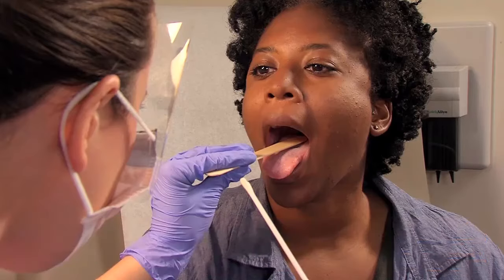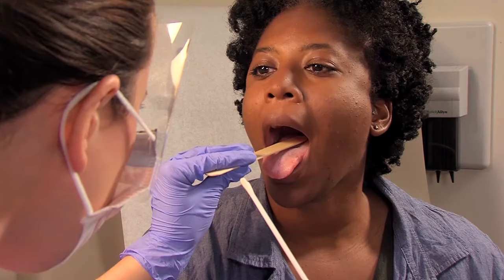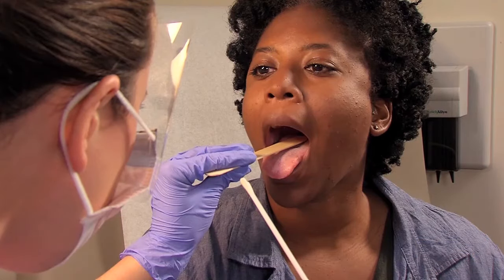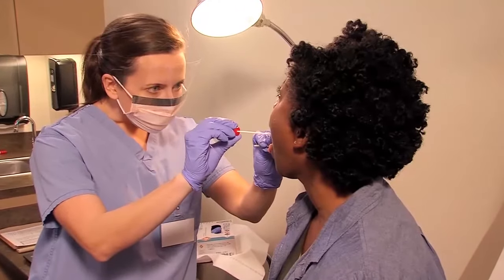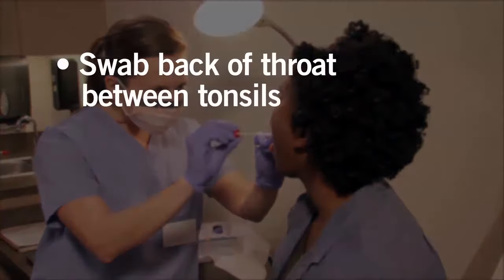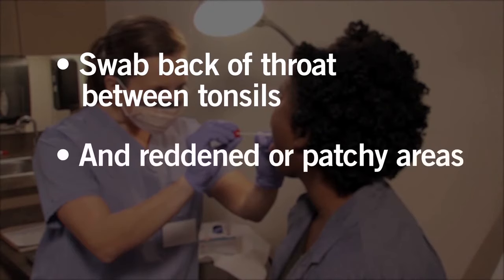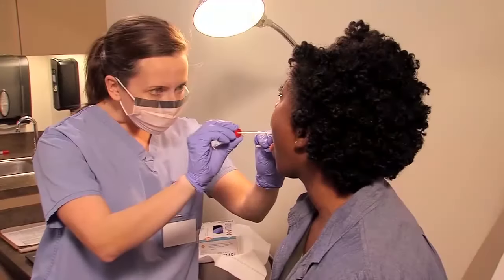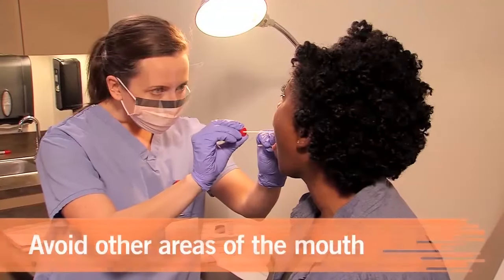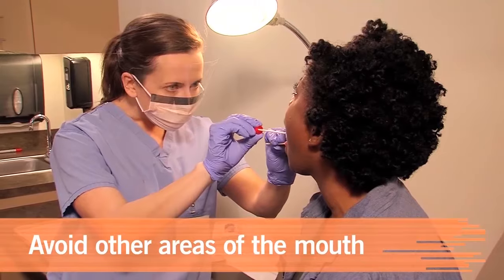Depressing the tongue will allow you to see the back of the throat and help prevent contamination of the sterile swab. Using a figure-eight motion, gently swab the back of the throat between the tonsillar pillars. Be sure to sample the tonsils and any reddened, patchy areas, white pus pockets, or purulent areas. Avoid touching the rest of the mouth or the tongue with the swab.